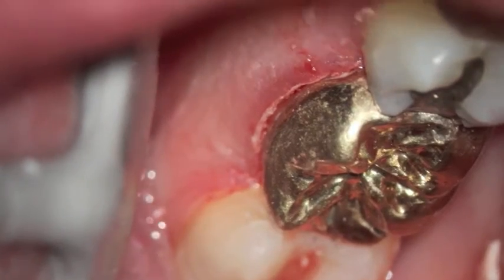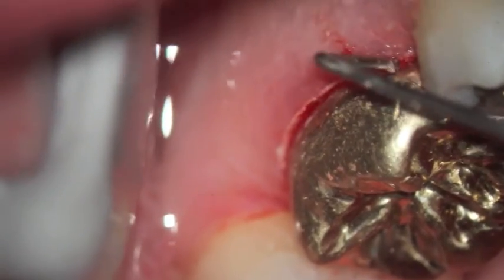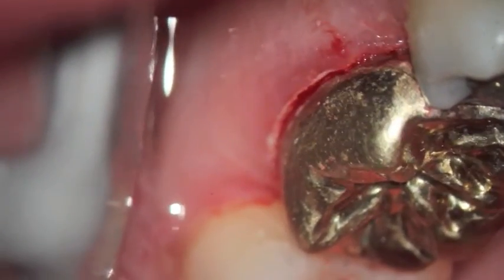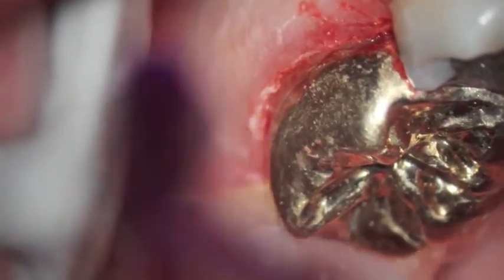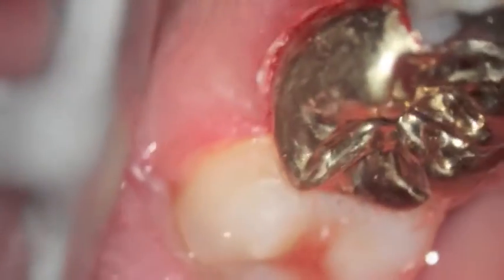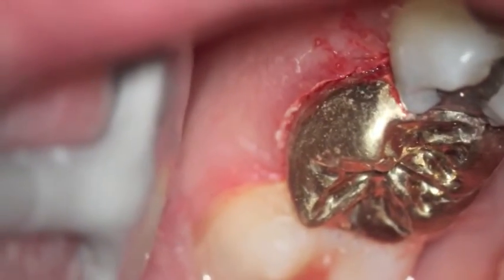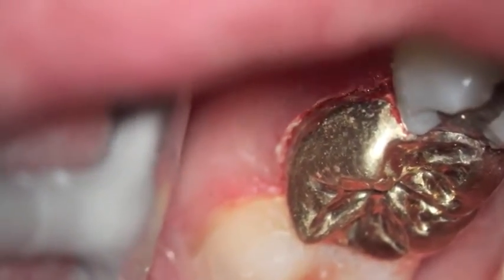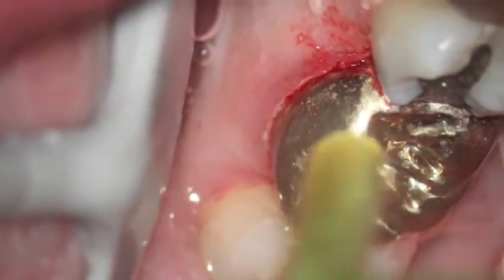And this is in a spot where most people wouldn't be able to see it, the lower right first molar, tooth number 30. And it takes a lot of wear. The nice thing also about gold is when you chew on it, it doesn't wear the opposing arch as some of the ceramic crowns do. This patient, after we place the crown in, hasn't had any problems with the crack or chewing and is able to chew as much as possible.